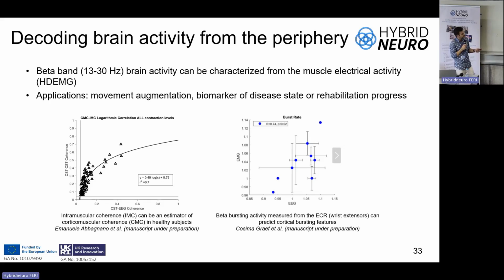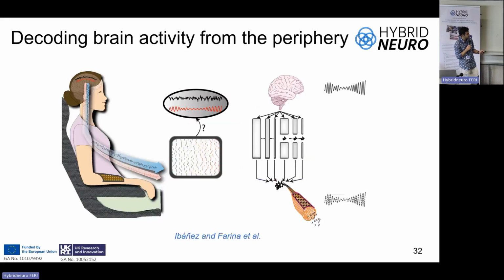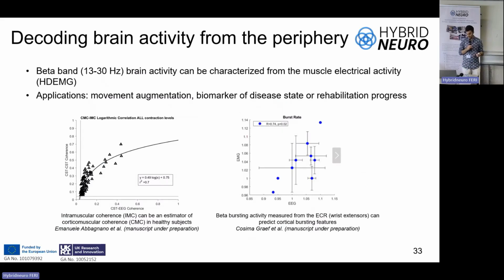And then we have this other correlation. This is more challenging. While the TA is a perfect muscle to study, when you move to the forearm, you have many muscles. You try to decompose, and you have excellent subjects and horrible subjects in terms of decomposition: you get 2 units and you can't do anything about it. In this case, each dot represents a subject with a few trials for 20% MVC of wrist extension. We measure the burst rate, coming back to this presentation: the rate or occurrence of this burst activity when it's above a given threshold. We measure that rate, and how it's happening at the brain level, measured with the EEG in one channel.